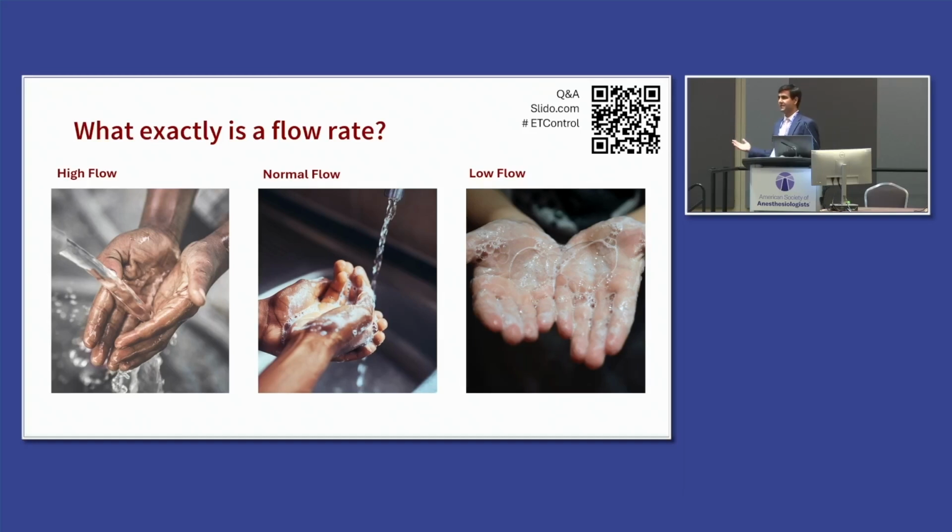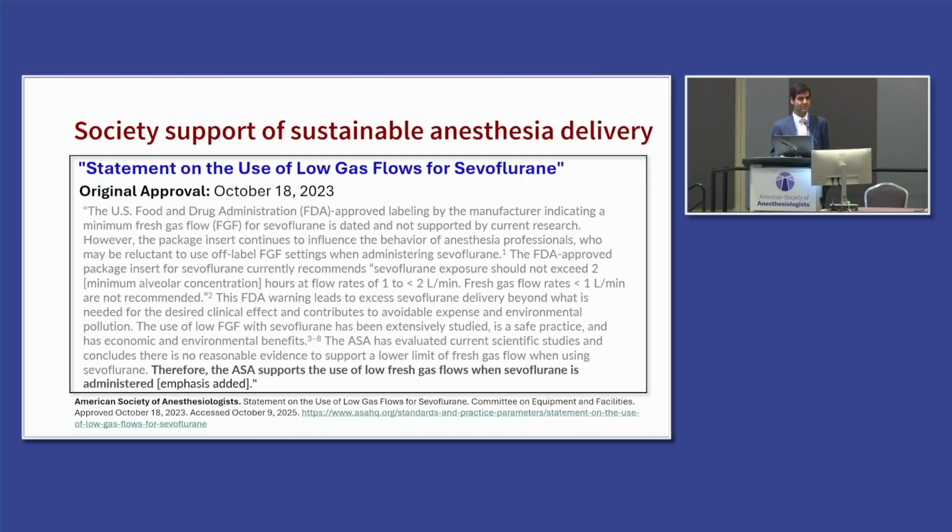I knew the next thing they were going to ask was, well, is it safe? Because they care about that. And this was very fortuitous for us, that on the ASA website a few months before that, they actually put out a statement encouraging the use of low flow. So that worked out really well.